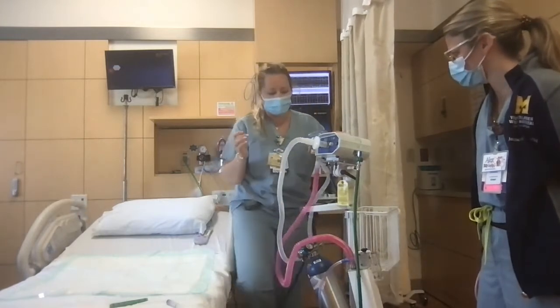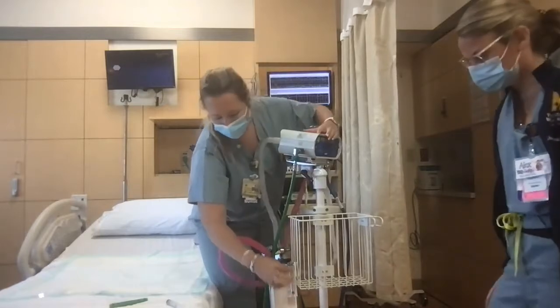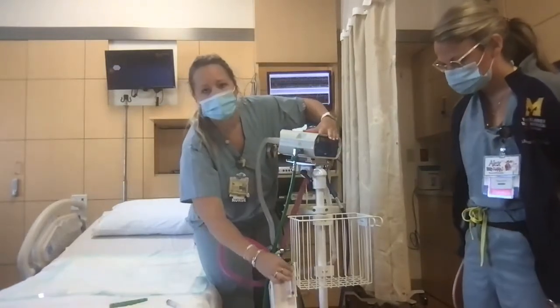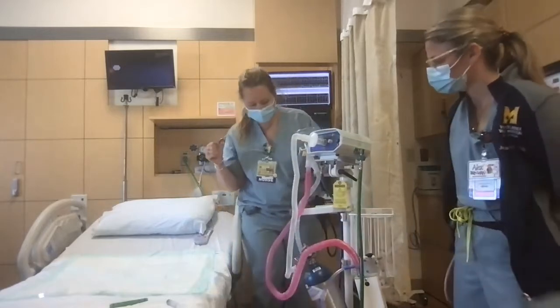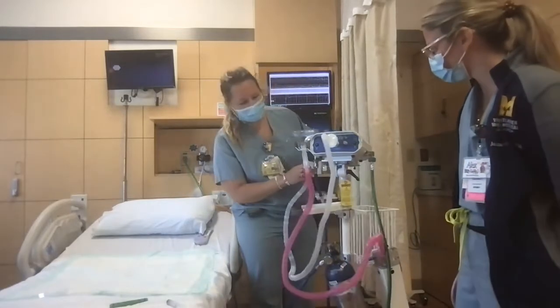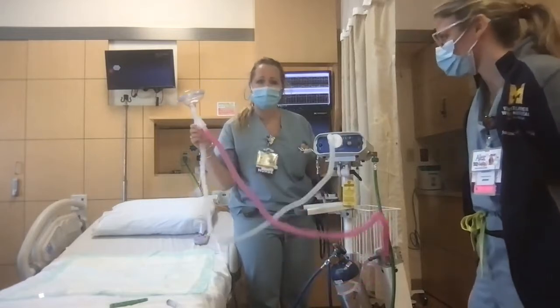I also want to make sure that the suction is actually working here on the machine, and it is. The little bead is at the top, so the suction is also working here, and you can hear it. The last thing I want to do is turn the machine on, and it should be all set for patient use.